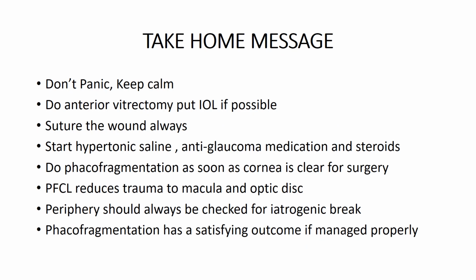So the take home message is: don't panic, keep calm, suture the wound always, and do phacofragmentation as soon as the cornea is clear. The periphery should always be checked for an iatrogenic break.